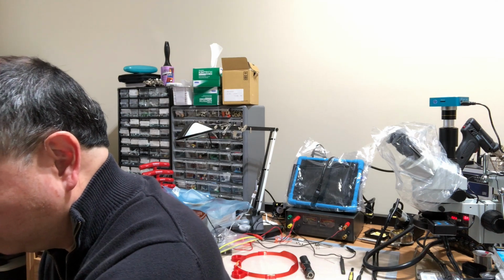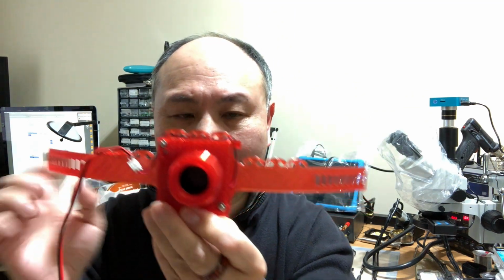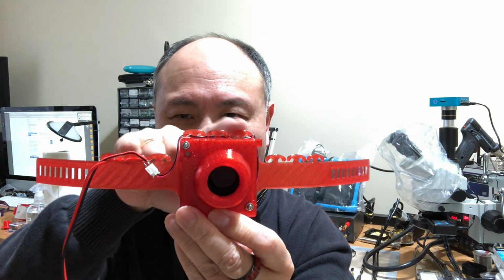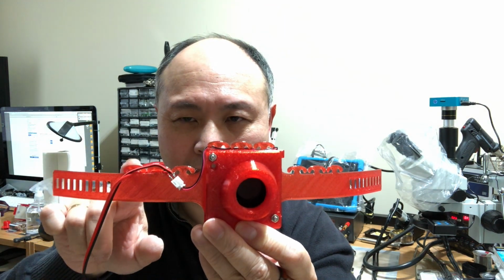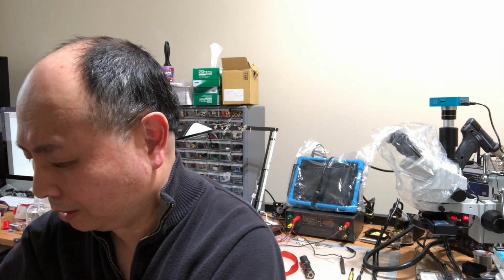Finally, wiring up the fan unit. We used to have to use a zip tie or twist ties to secure the loose portions of the lead. You don't have to do that anymore. The frills along the new fan mounting band let you run the wire through the frills to secure the thin wire for the fan unit. And on the current Halo loop, I'll show you in just a moment.